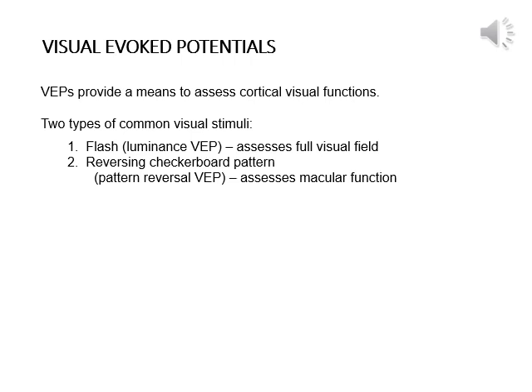The second type of visual evoked potential is generated by a pattern reversal. And so this is a difference in contrast between black and white squares that reverse black and white. They reverse their contrast every so often. And so that reversal creates an evoked potential. And this is used to look at the function, particularly of the macula, because it stimulates receptors in the fovea.